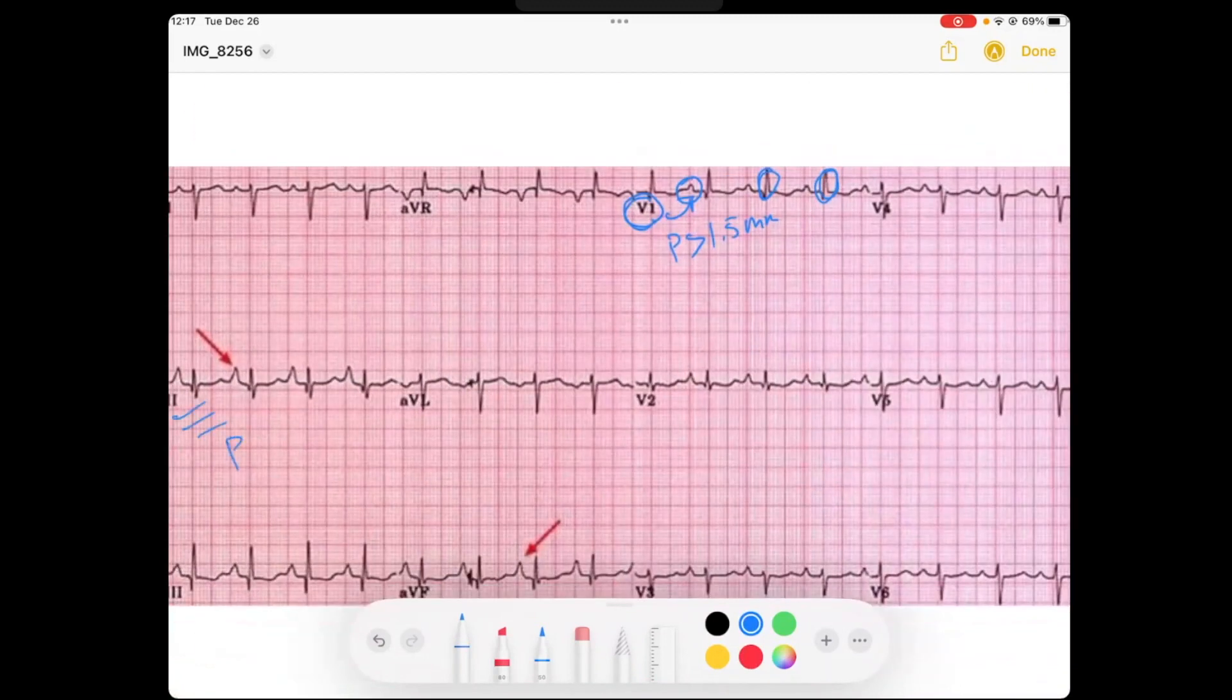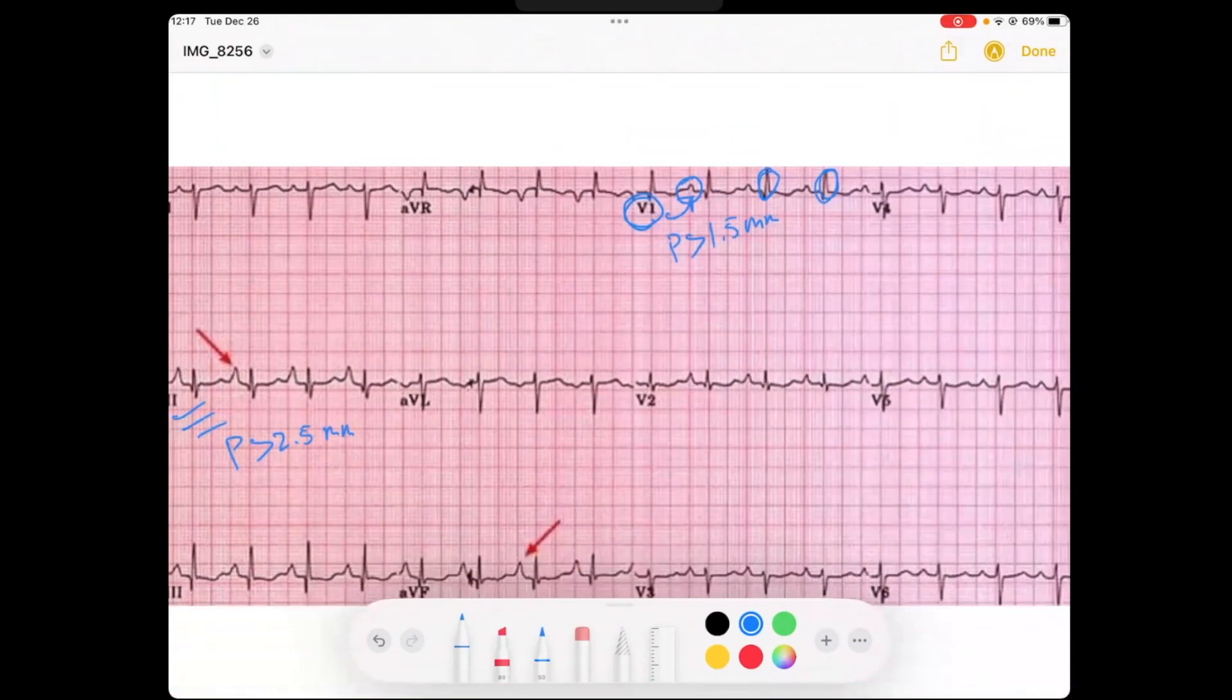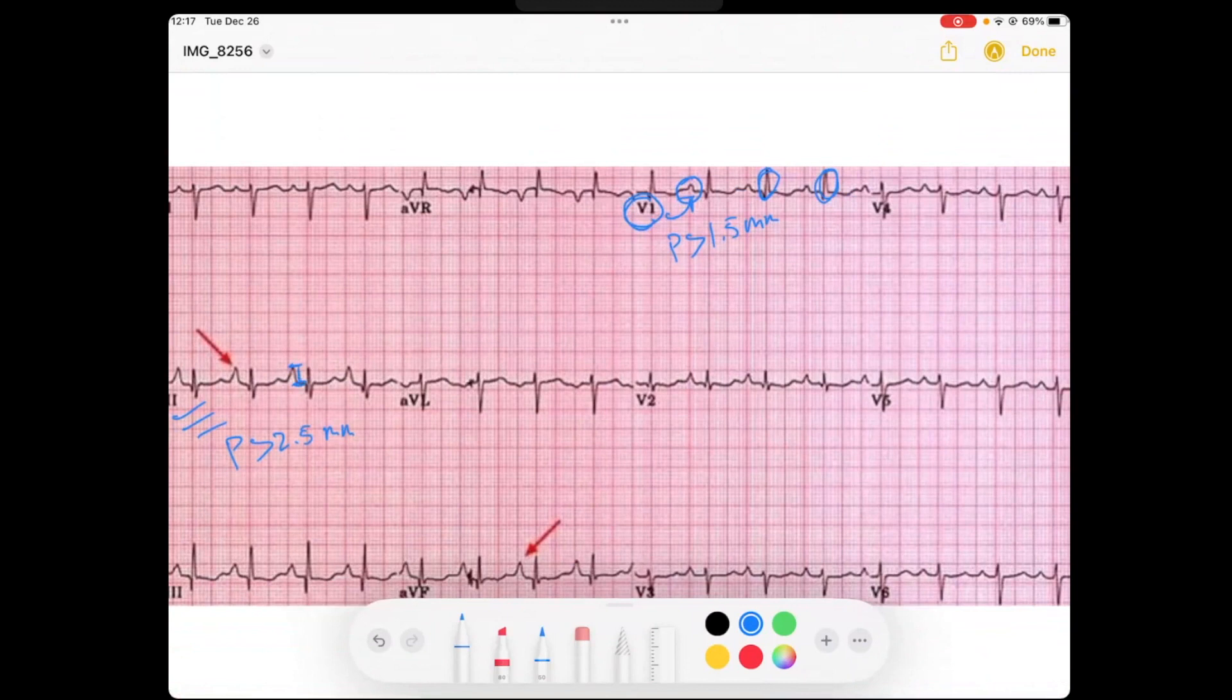So let's look over at lead 2. We said lead 2, if the P-wave is greater than 2.5 millimeters in amplitude, then we would have our diagnosis of right atrial enlargement. So if you look here, I would say that if I measure from superior to inferior, that is somewhere in between 4 to 5 millimeters. So there's my criteria for right atrial enlargement.